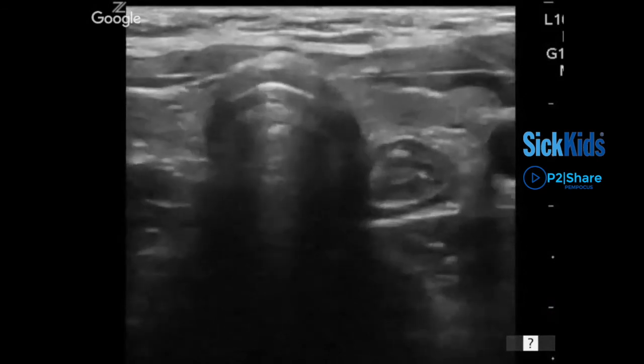So afterwards they pulled it, right? Yes, they pulled it out. So it's in, they pulled it out. Now you can see the picture we've seen before of the normal trachea and the normal esophagus. So in terms of our case, they pulled it out, they put it back in, and here they are doing chest compressions. And what do you think now?